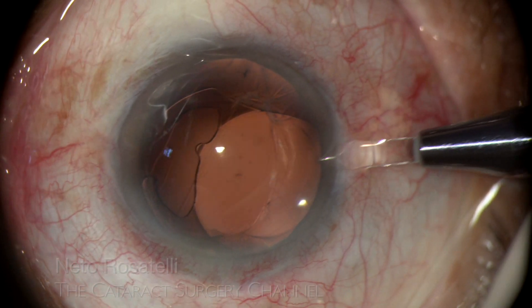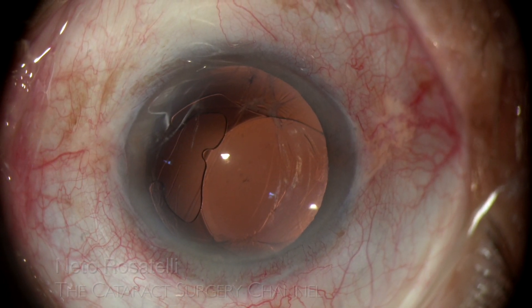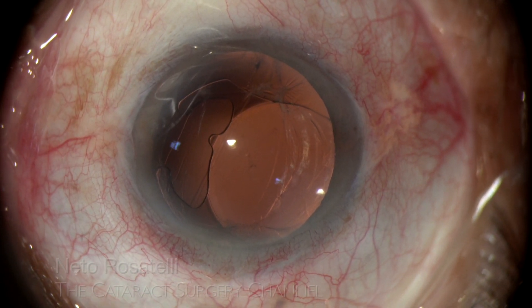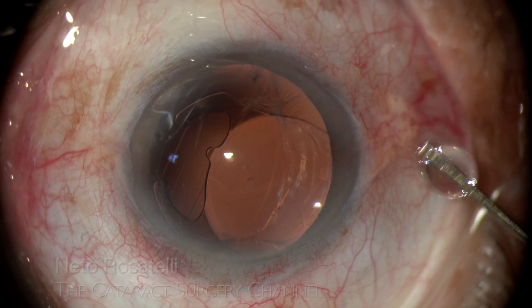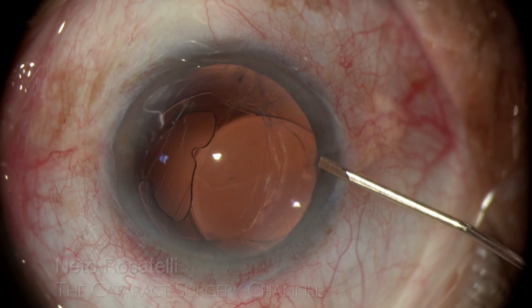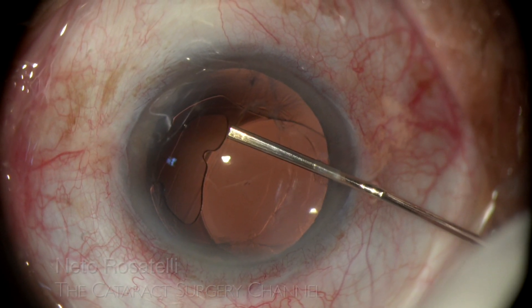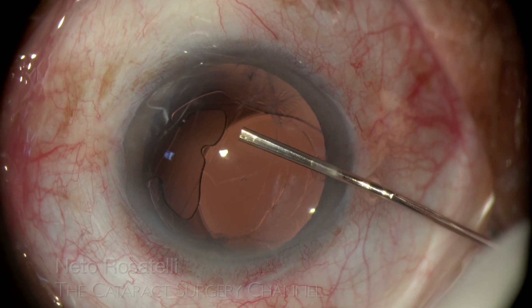Being that a single-piece acrylic hydrophilic lens, I will comment on that later. Two paracenteses are made with a 1.2 mm sapphire stab knife at 2 and 9 o'clock to gain anterior chamber access.